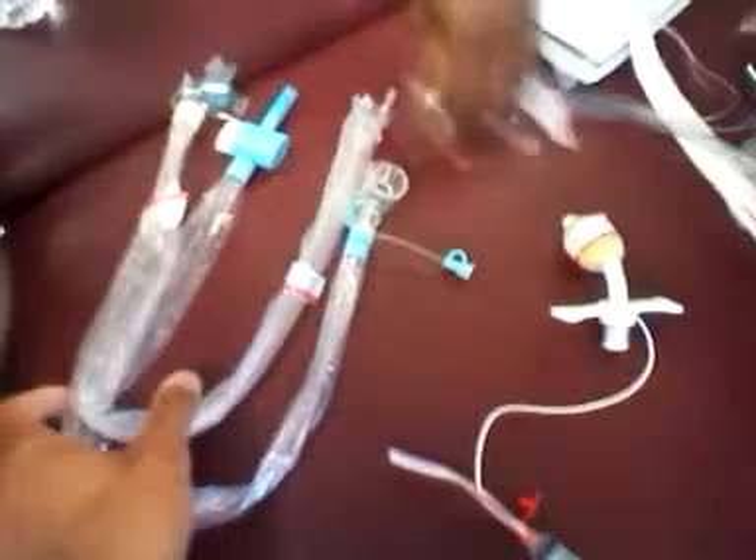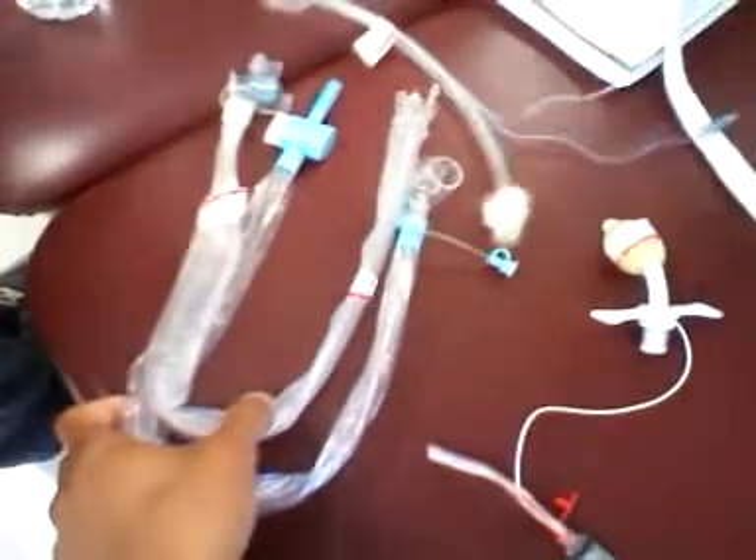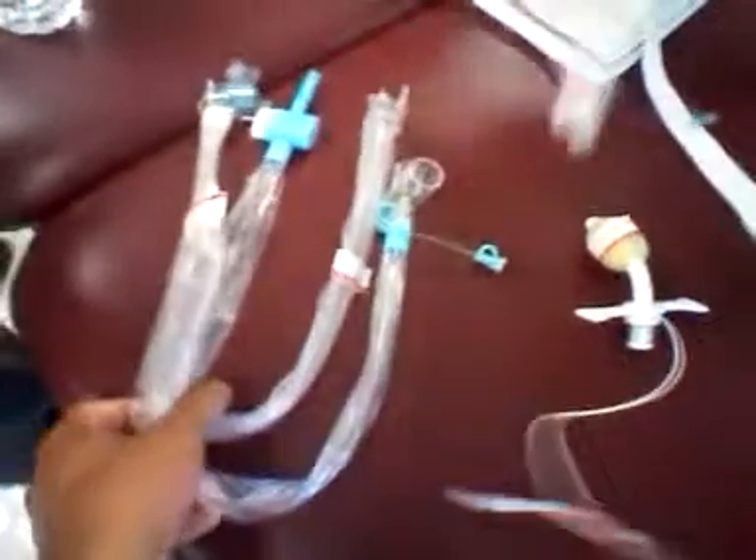How can you tell the difference? This one is the same as this one — these two are just the same closed suctioning thing, right? And then this is the endo one. Endo cycle. So which one is the closed one? This one — the one with the plastic. The plastic one is closed.